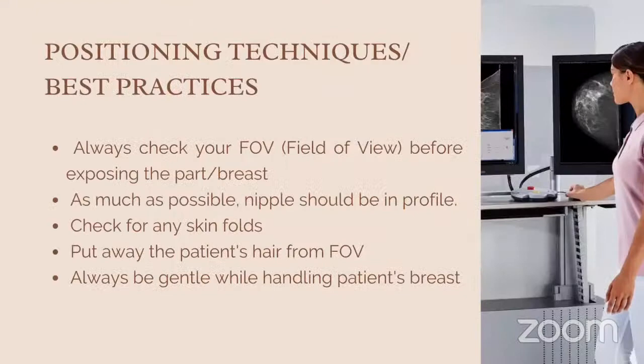Next, let me share with you positioning techniques or best practices in exposing the breast in mammography. First, always check your field of view before exposing the breast, because in mammography we have a limited field of view. Avoid any cutoff so that you will not have any repeat examinations. Next, as much as possible, the nipple should be in profile because it is a landmark or an indication of the mid part of the breast. Next, kindly check for any skin folds to avoid any superimposition in the breast.